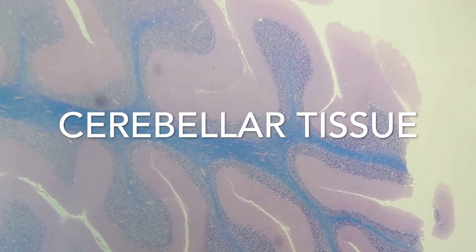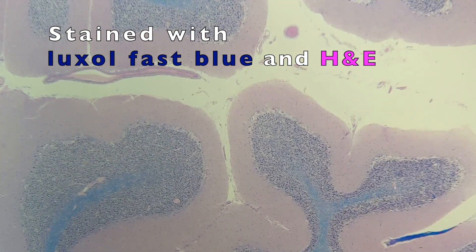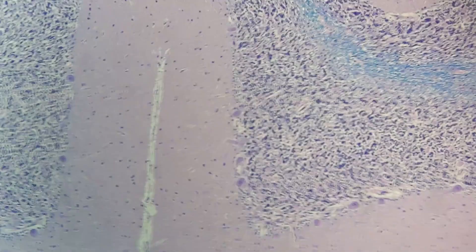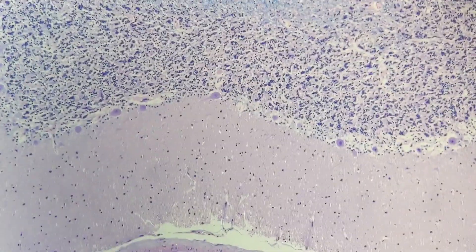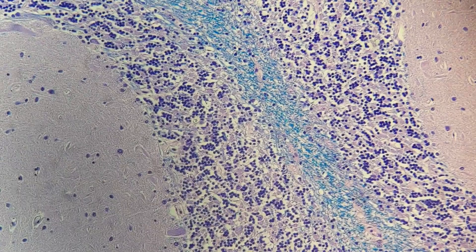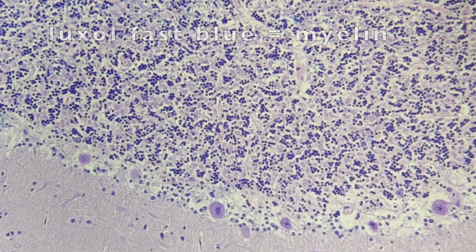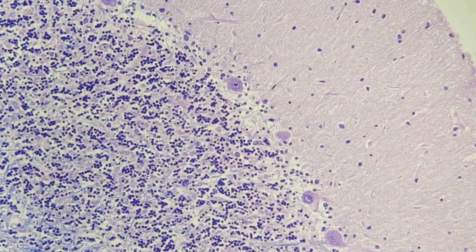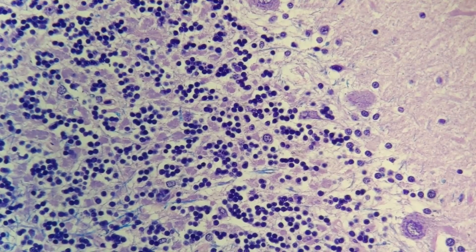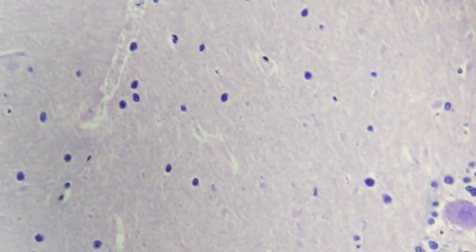Here's a recording of cerebellar tissue stained with Luxol Fast Blue — an H&E stain supplemented with Luxol Fast Blue dye, which intercalates with fat or areas with a heavy lipid bilayer, corresponding to myelinated fibers. The hematoxylin stains the nuclei, eosin stains the cytoplasm, and Luxol Fast Blue stains the myelin. You can see the eosinophilic molecular layer, the large Purkinje cell layer, and just beneath them, the internal granular cell layer of the cerebellum.